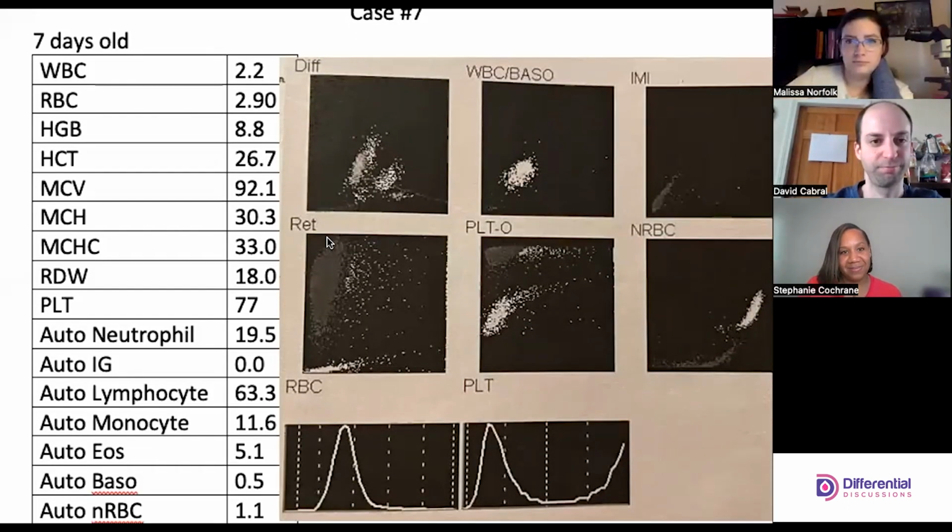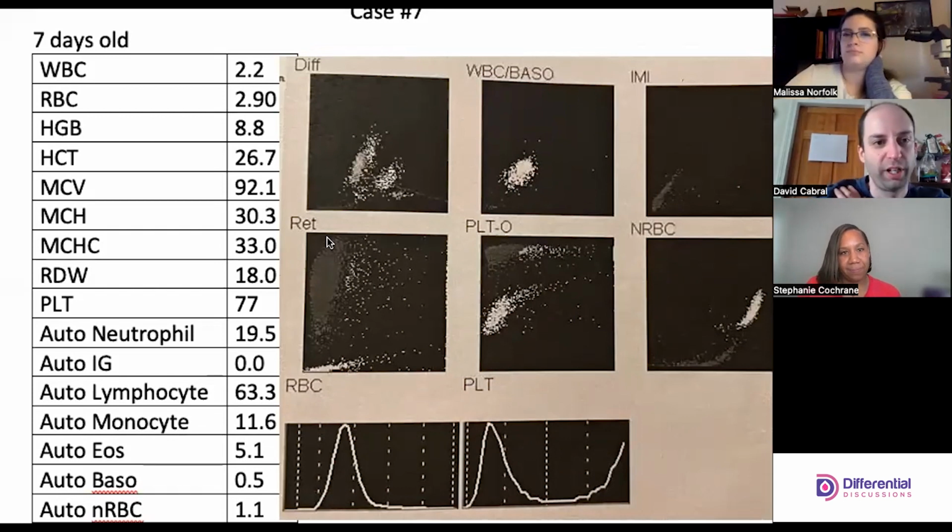You guys ready to see the CBC? Please and thank you. All right. Another low white count. Yep. Low platelet count again. Low platelet and H&H. Yeah. Anemia. So we have pancytopenia, but again, it's kind of middling. It's not crazy.